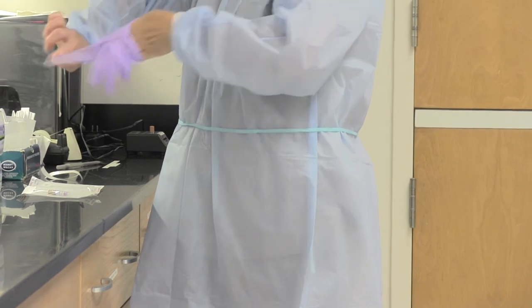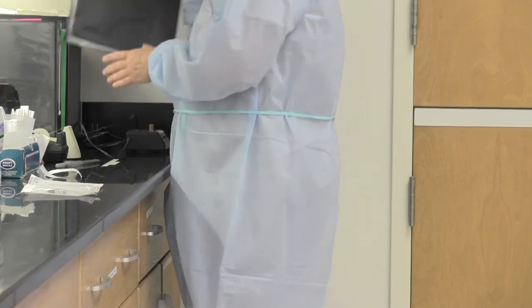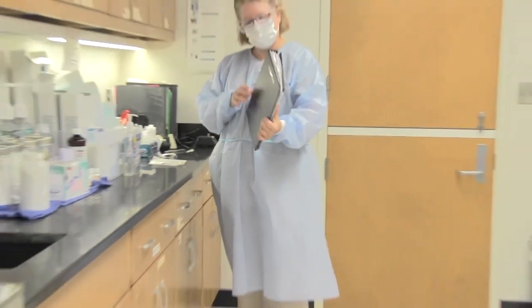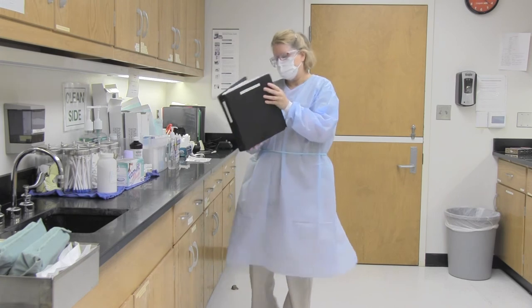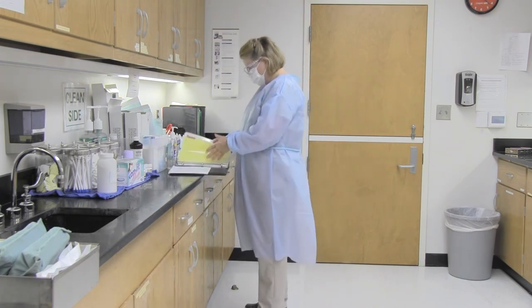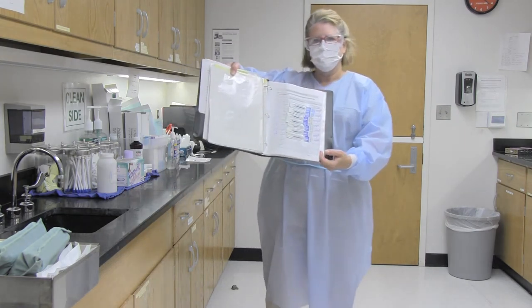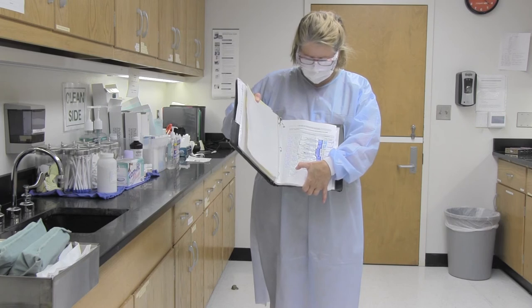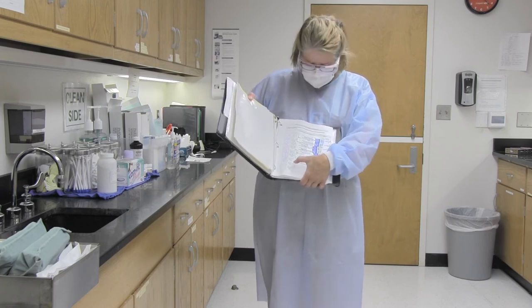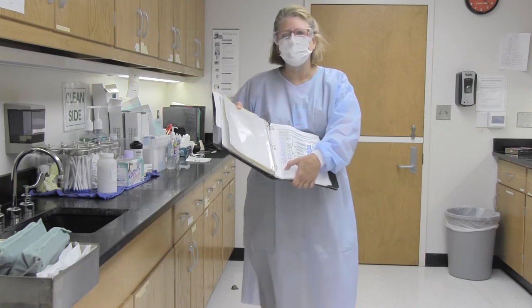Place the integrator strip into the sterilization monitoring book. This is our sterilization monitoring book — it has a place for the biomonitors and for the integrators. We will tape the integrator in and circle the autoclave number: autoclave 1, autoclave 2, magnaclave, or statim. We will record whether or not it has changed, the date we took it out, and our initials.